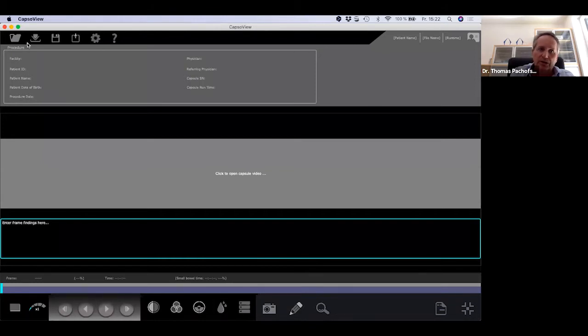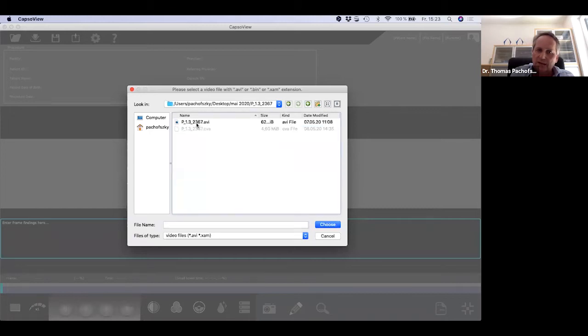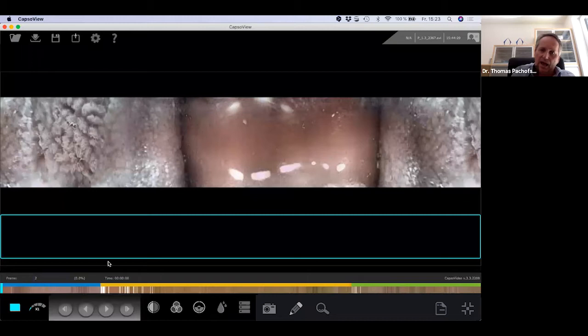And I will show you here the software. It's quite easy software, and I think all you can see will be quite easy. You have here a folder to open the video. So I can click here, and I have here my videos I have prepared for our online course, and I will start now with this. And you can see here now a lot. We have a blue color for the first part of the examination, the stomach, then yellow for the small bowel, and green for the colon.